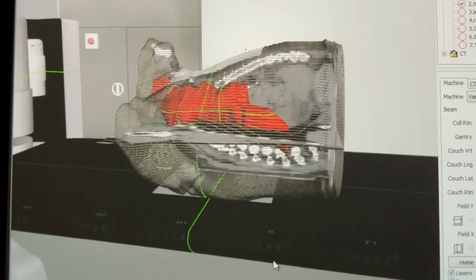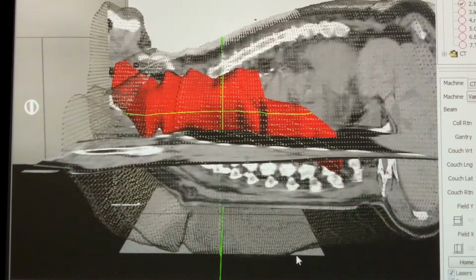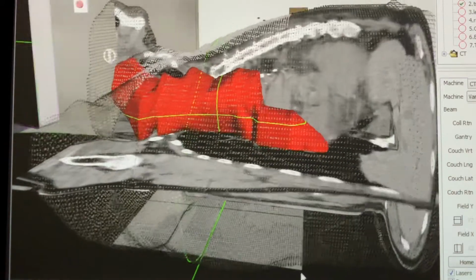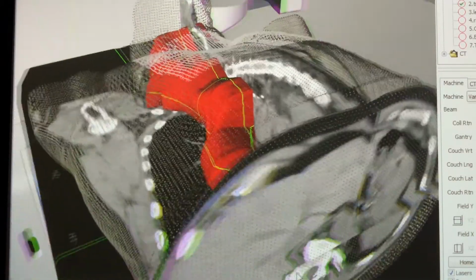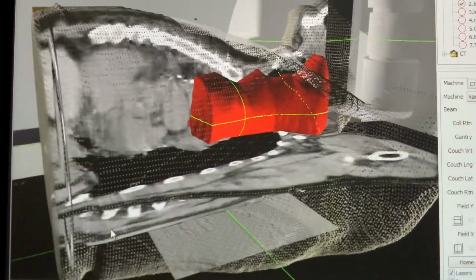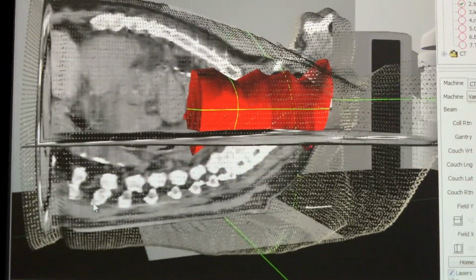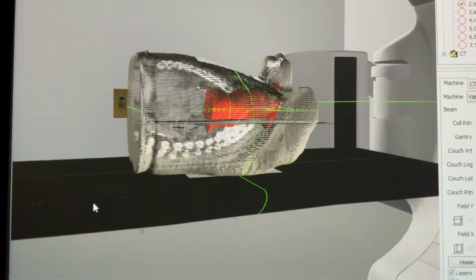During daily treatment, the therapy team will use the devices created during simulation, as well as those tattoos, in order to position you to the exact way you were. Using the laser system in the room, the therapist will adjust you to line up these tattoos. It is important to let them move you and not adjust, even if it feels like you are twisted.